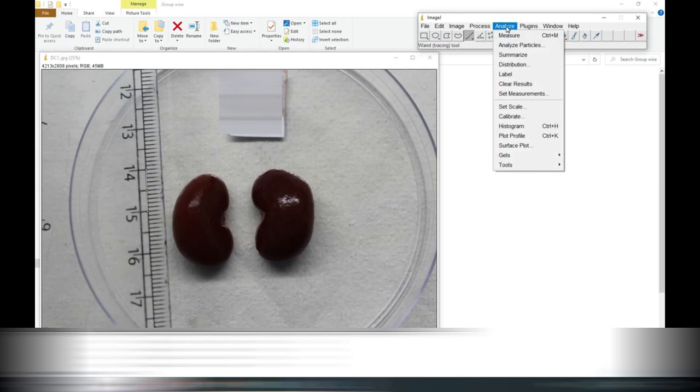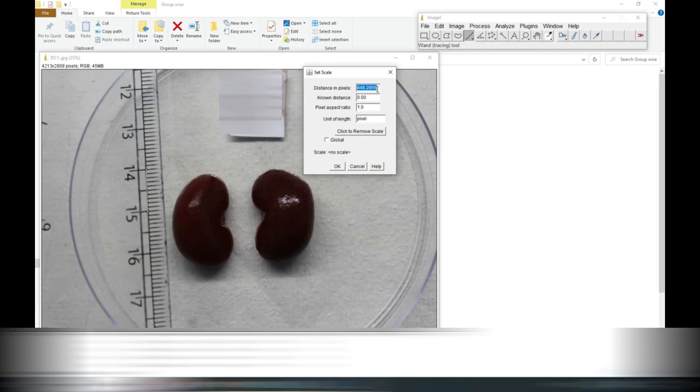Here we will set the scale and you can see it is a pixel measurement that is in blue. Now you have to add here the known measurement means 10 mm that we measured here in the scale and now we will write here the units.